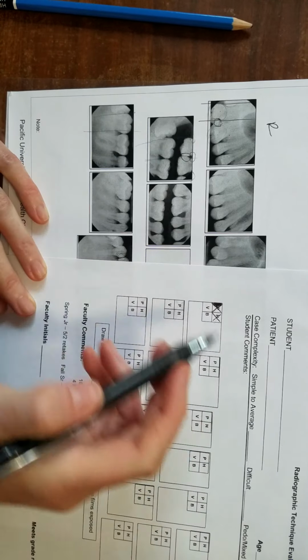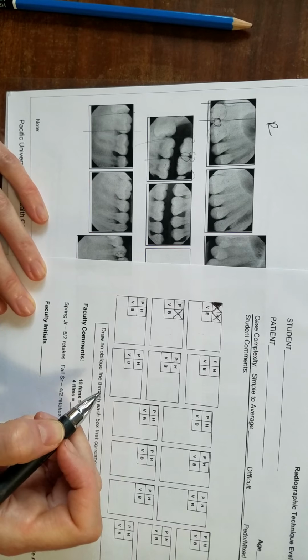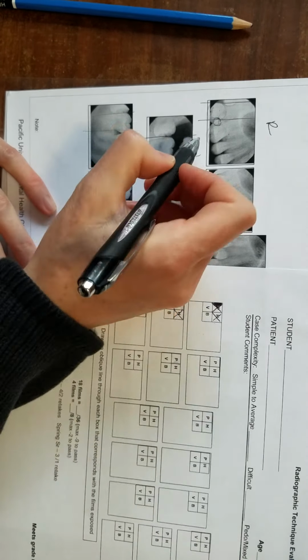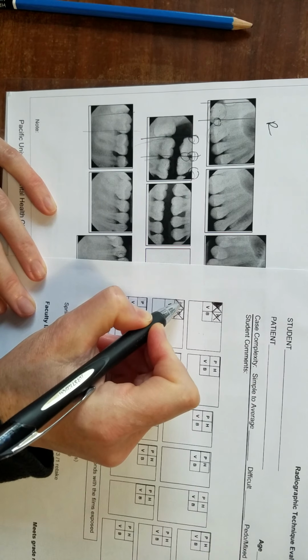And then on this film down here, there's a tiny little bit of overlap again between 2 and 3. So we'll put horizontal angulation there. Our second molar is right in the center, so that's great, but we can't see the alveolar crest here. So that's a positioning error.